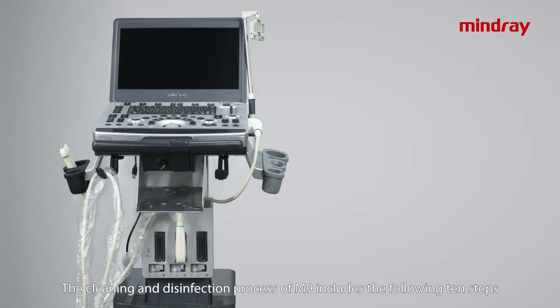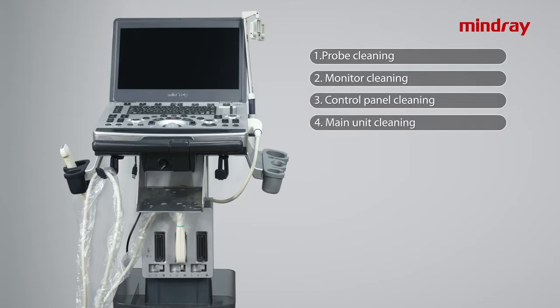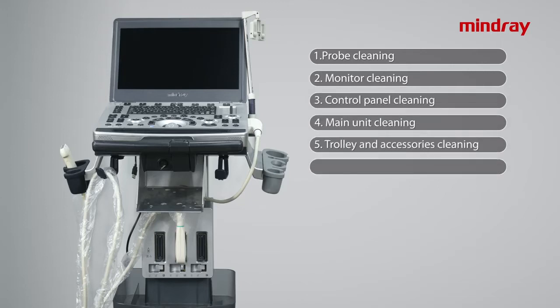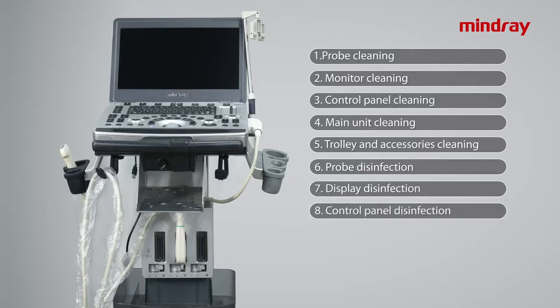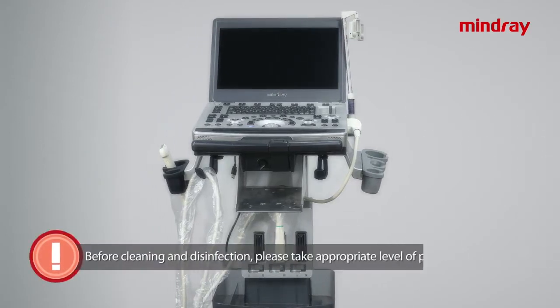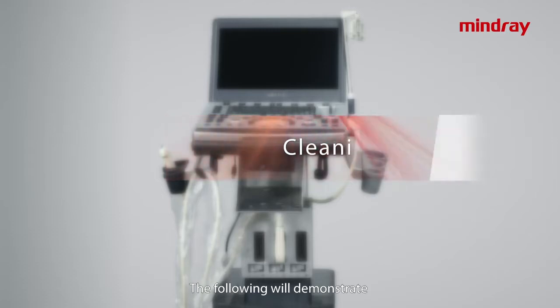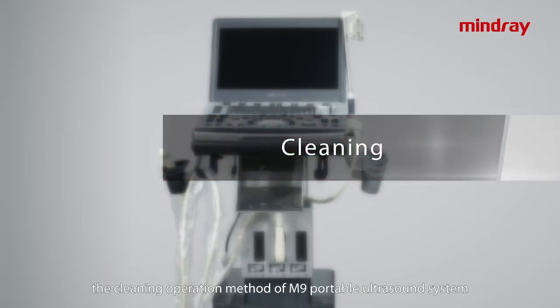The cleaning and the disinfection process of M9 includes the following 10 steps: probe cleaning, monitor cleaning, control panel cleaning, main unit cleaning, trolley and accessories cleaning, probe disinfection, display disinfection, control panel disinfection, main unit disinfection, trolley and accessories disinfection. Before cleaning and the disinfection, please take appropriate level of personal protection. The following will demonstrate the cleaning operation method of M9 portable ultrasound system.